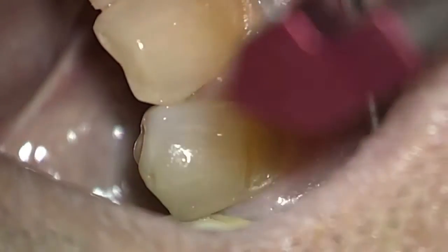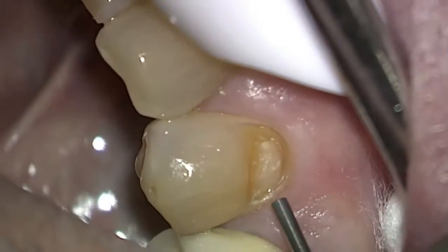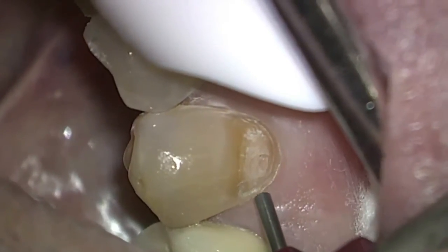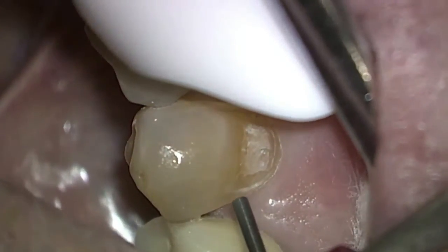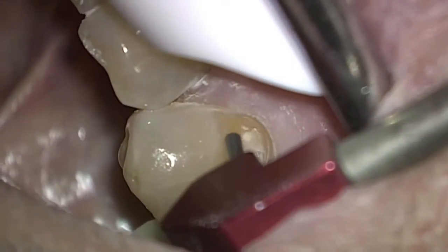Here is a tooth that had acid erosion — pretty severe. It had been bonded with a filling, but the erosion actually expanded around. So we're going to remove the rest of the old filling and place a new one.